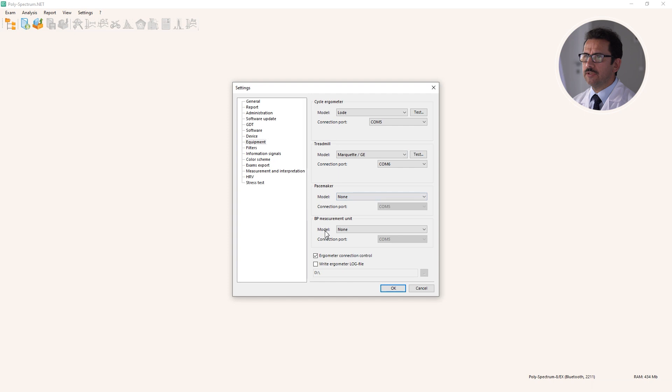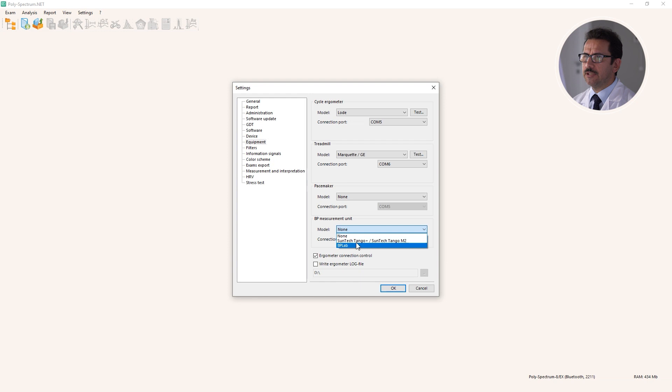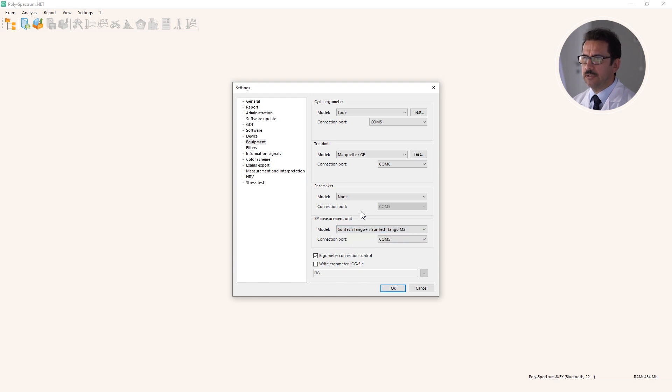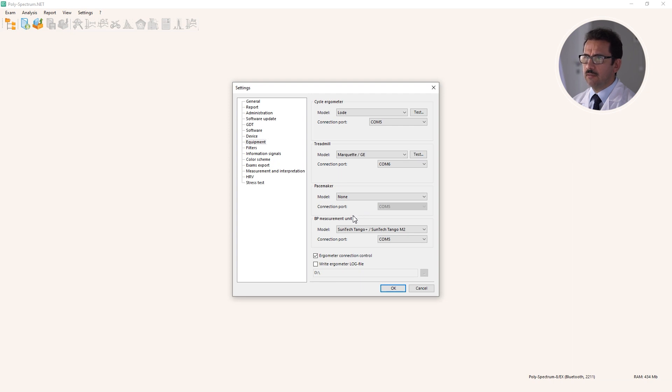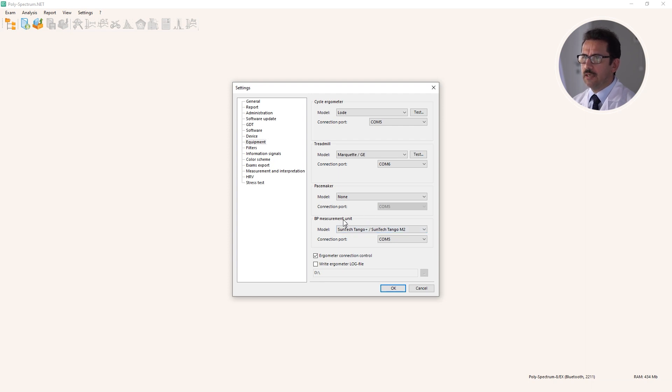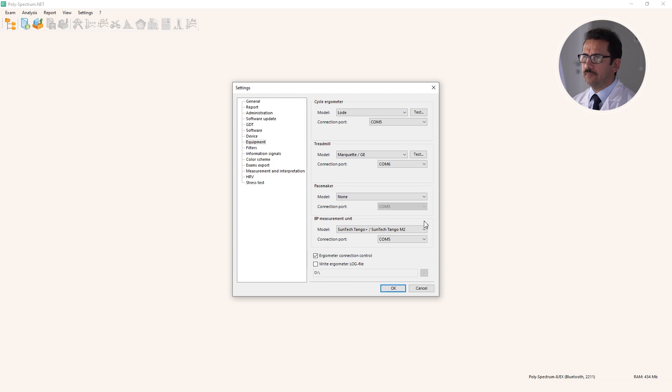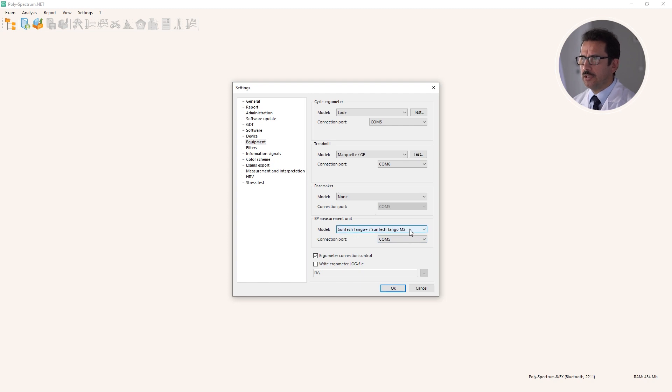Pacemaker is not so interesting, but blood pressure measurement unit - the software supports Suntec Tango device. As we discussed during the test, there are a couple of electronic measurement devices that are dedicated especially for exercise stress testing, and most of the devices are produced by this Suntec company or they include their chip inside. So you can purchase the device and connect it to the software.